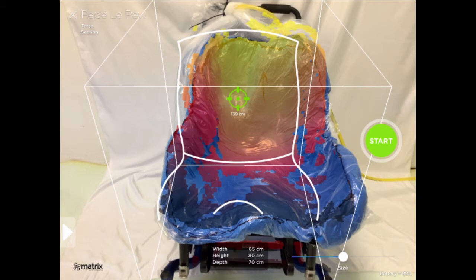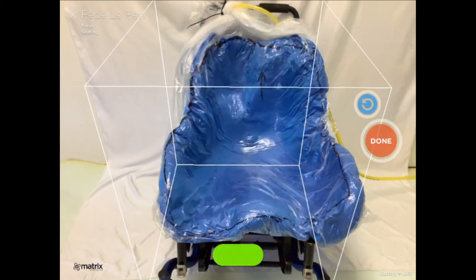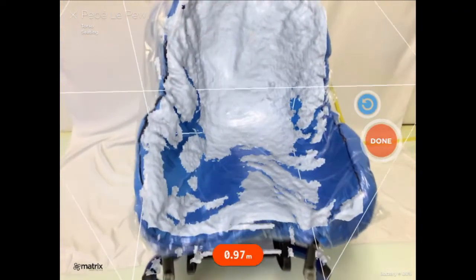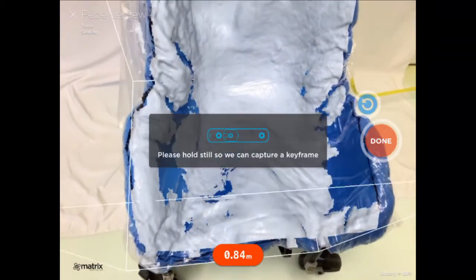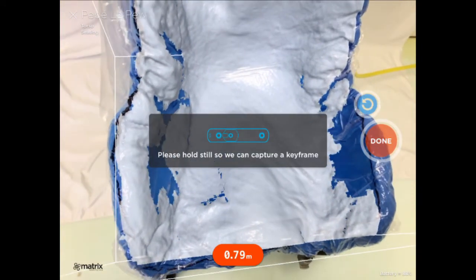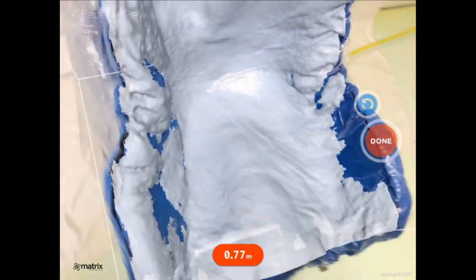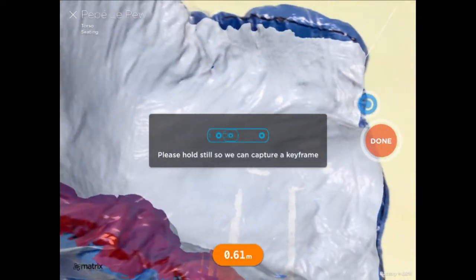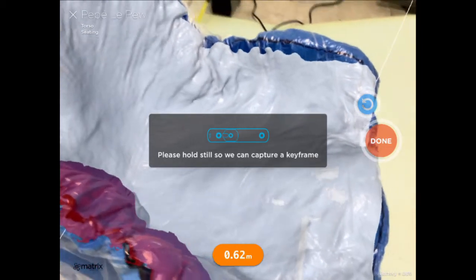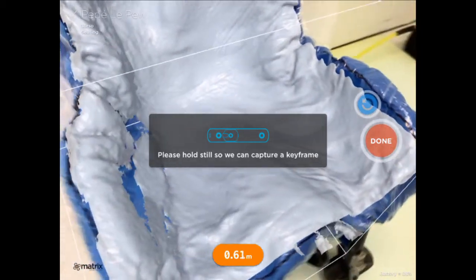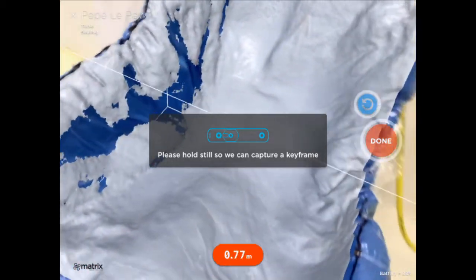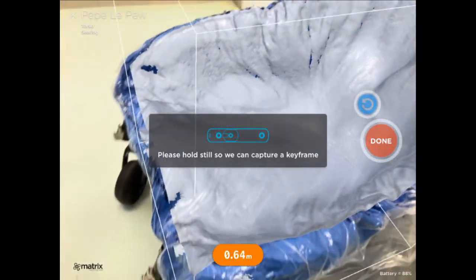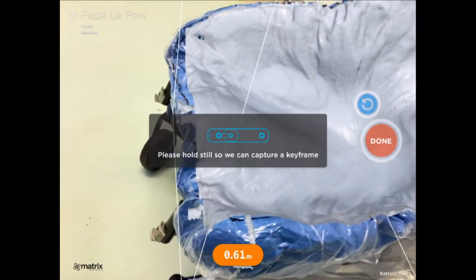As the shape of the system is scanned, it will turn white. You should move around the object slowly at a distance of about 2 to 3 feet, making sure that there are no holes in the white scan and that every inch of the impression has turned white.